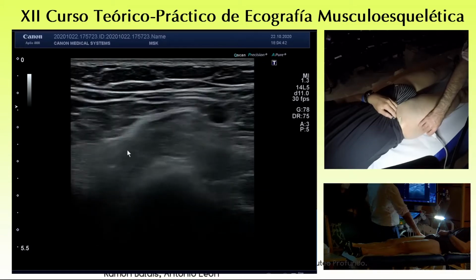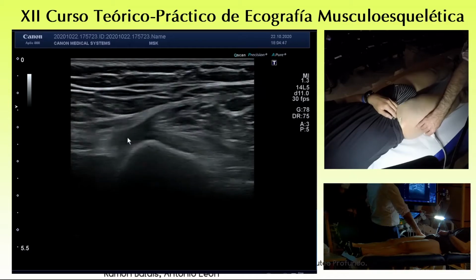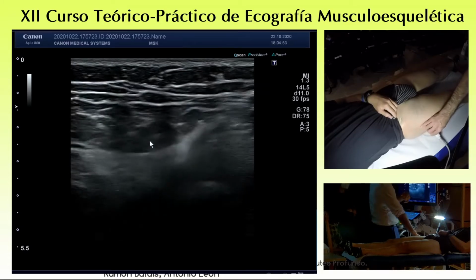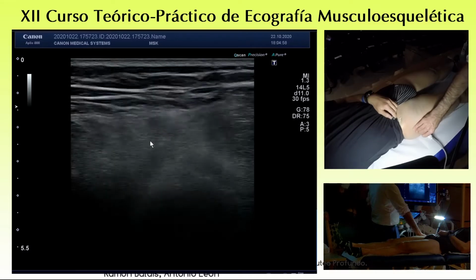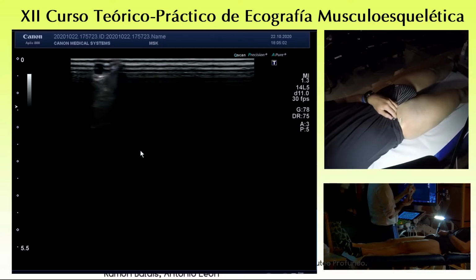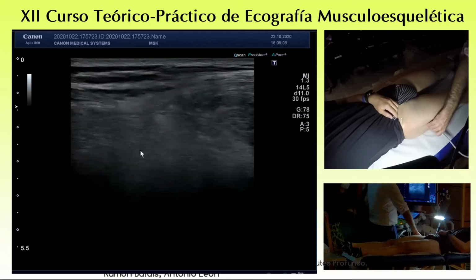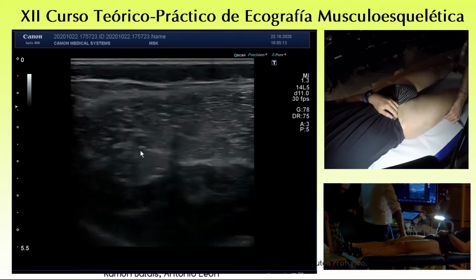So when you look at the fasciae latae, look at the insertion, look where it goes close to the trochanter at this level, and of course check also the level of the knee. Okay, because there is the so-called runner's knee. This mechanism is the same as the lateral snapping hip. Okay, it is the fasciae latae that is scratched against the lateral condyle.